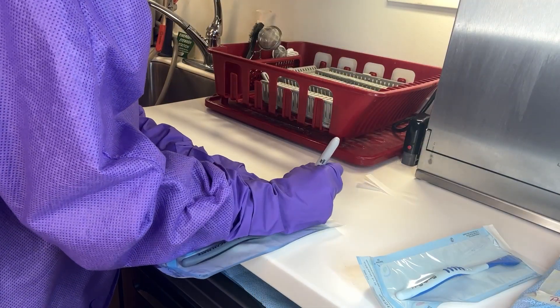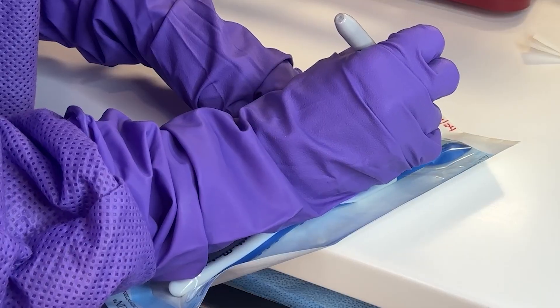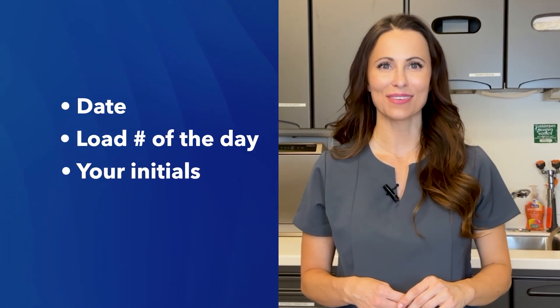In addition, proper labeling of each package is crucial for tracking and ensuring correct handling post-sterilization. Before the item goes into the sterilizer, it should be labeled with the sterilizer being used — for example, autoclave A — then it should have the date, the load number of the day, and the initials of the person packaging the items.